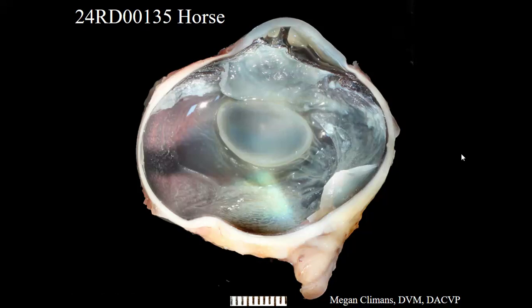This can be a common artifact during trimming of eyes. You can get bubbles trapped underneath the retina. And especially in horse eyes, the retina artifactually detaches all over the place all day long. We can confirm or rule it out potentially histologically.